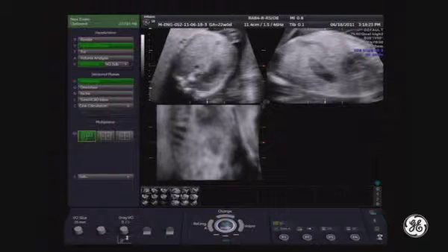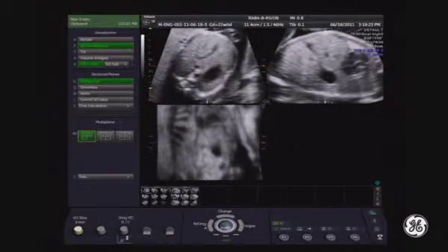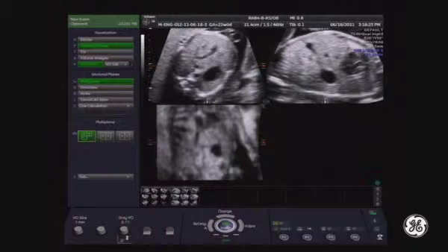We have 20 millimeters. That's why it doesn't look so nice. Let's reduce the slice thickness to about 3 or 2 millimeters. So you start seeing the structures because the slice thickness is smaller, and the averaging of the signal and contrast is made just on the parallel layers.